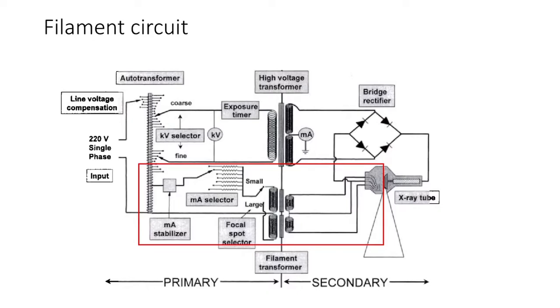It should be noted that with different models and different makers of X-ray generators, we might find more devices, some of which are supporting, some of which, because of modern technology, simplify the process. But the ones we have spoken about right here are the most basic. So let me highlight some additional components which help make the exposure, the X-ray imaging, easier.